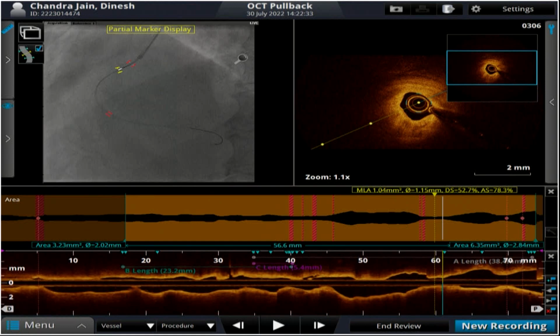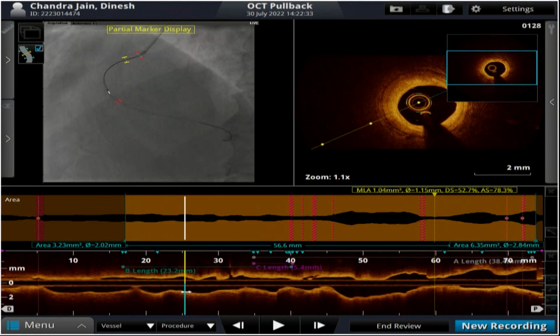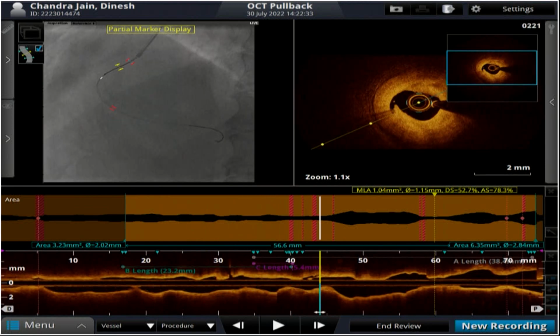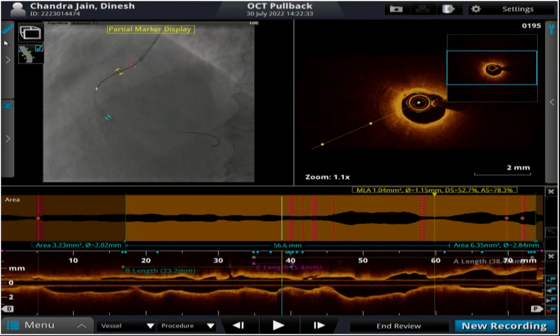No, I just want to remake the point. You are saying that you got co-registration just injecting saline, and the contrast that was there in the catheter was sufficient to give you that co-registration. Is that right? No, sir. Co-registration does not require contrast. For the 4th time, it does not require contrast.